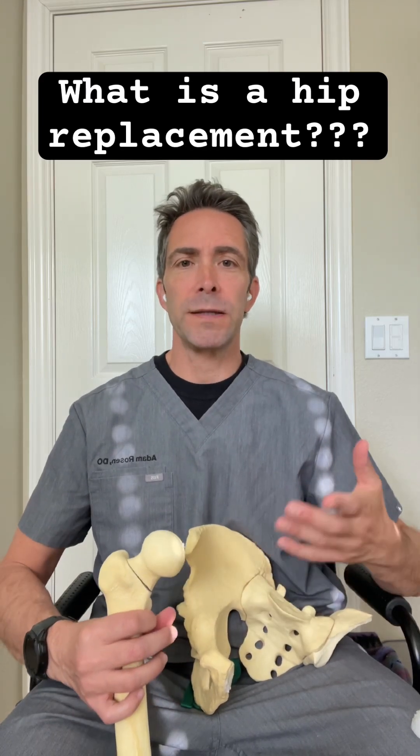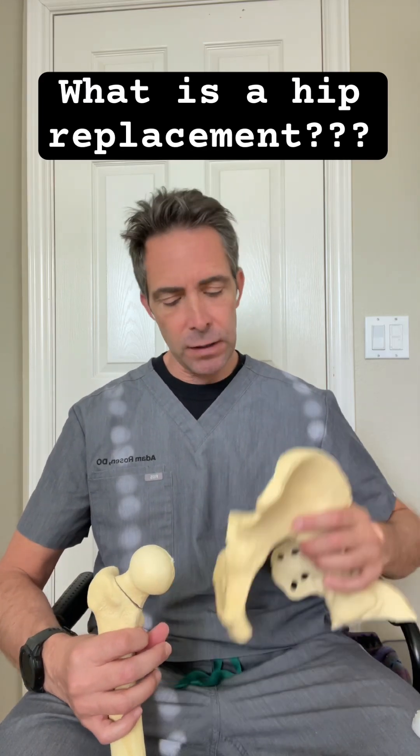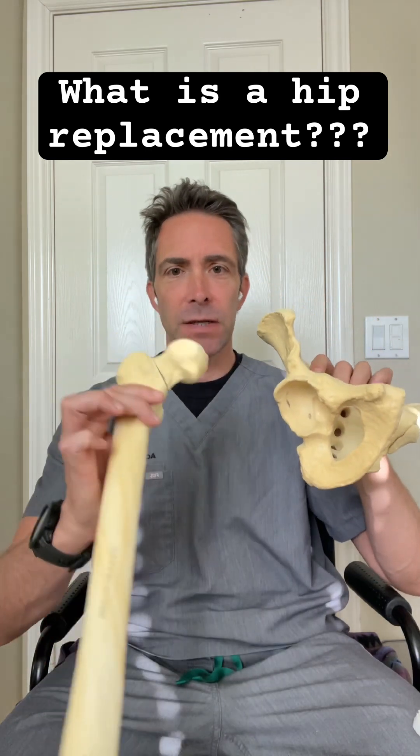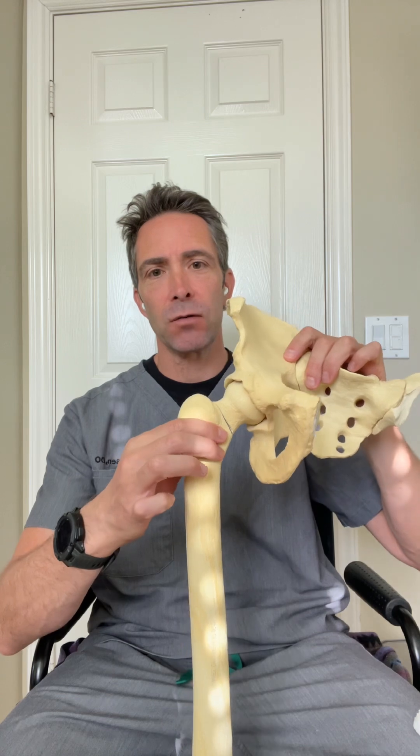Patients frequently ask me, what is a hip replacement? So if you look at this, this is half of the pelvis. This is the cup. This is a thigh bone with what's called the femoral head attached. And this is your normal hip motion in the hip socket.